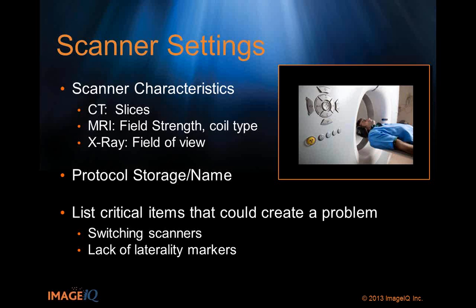Right, definitely. So the next thing as we talk about scanner settings is certainly the protocol storage and the name. We want to save the protocol on the scanner to the extent that it's possible. Now, when we get to ultrasound, we can certainly store a lot of things, but it's very tech dependent. Even with X-ray, it's pretty tech dependent. Positioning exactly right, and the personality of the tech really comes through if they can get the patient to really do what they need them to do.